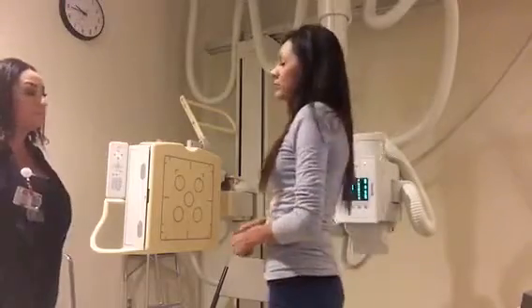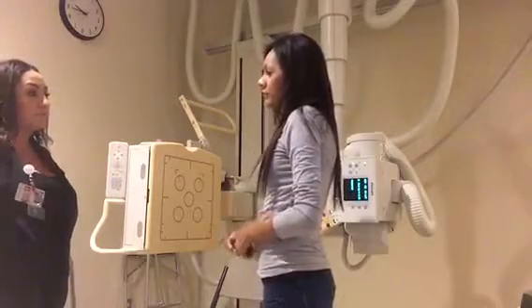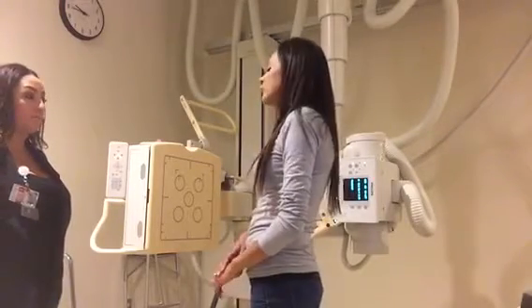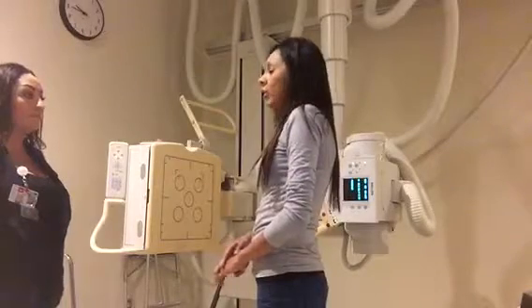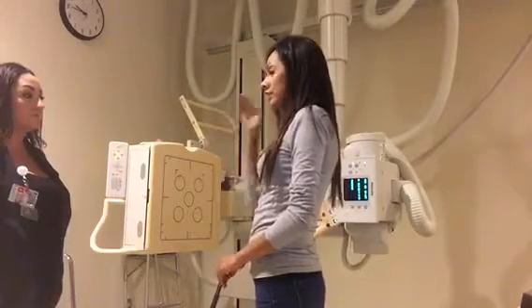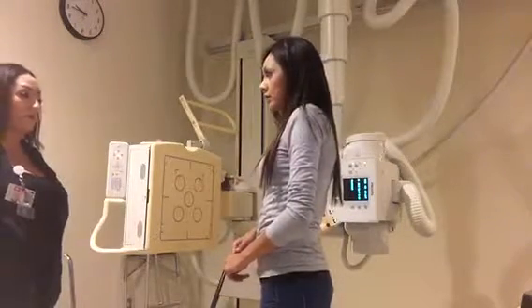Hi, my name is Yahida. I'm from radiology. I'm going to be taking some x-rays. Can I get your full name and date of birth? Anne-Marie Montalvo, 5/15/80. Okay. And is there any chance of pregnancy? No. Okay. Do you have any history of high blood pressure, diabetes? No. Any heart or lung conditions? No. Okay. So for the exam, you're going to have to take out any hairpins, if you have any, and also if you're wearing any dentures. No, I don't have any of that.